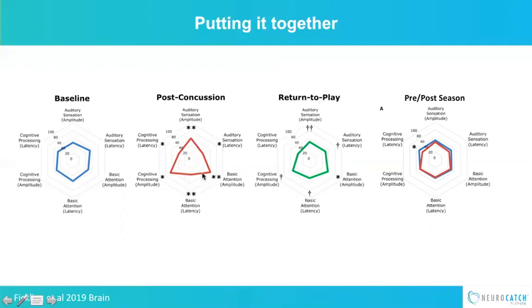We're pretty excited. We're looking in the science and research if this can be used as an electrophysiological biomarker of concussion, which would mean, by the way, you wouldn't necessarily need a baseline, and you could monitor your athlete who came into you with a concussion to get them back to a healthy hexagon level, which is a standard that you can use. Now, when they were returned to play, this is just to drive home the point that they start to go back towards a healthy hexagon shape.